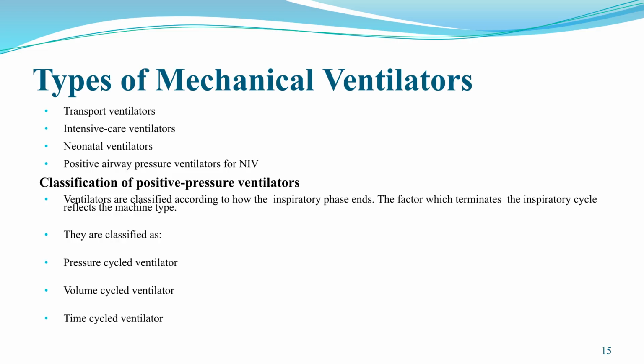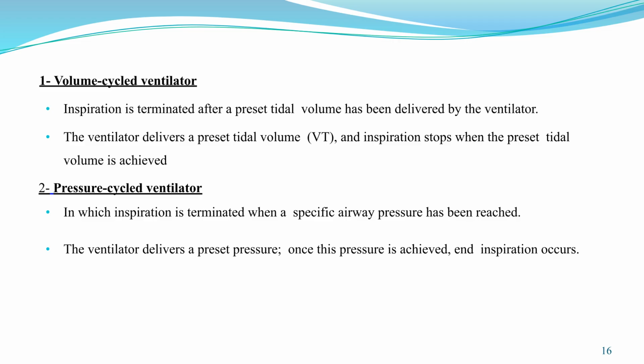Types of mechanical ventilators include transport, intensive care, neonatal, and positive airway pressure ventilators for non-invasive ventilation. Positive pressure ventilators are classified by how the inspiratory phase ends: pressure cycled, volume cycled, or time cycled. A volume cycled ventilator terminates inspiration after a preset tidal volume is delivered. A pressure cycled ventilator terminates inspiration when a specific airway pressure is reached.